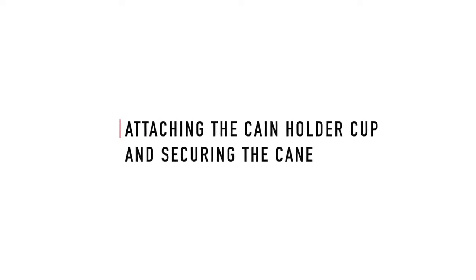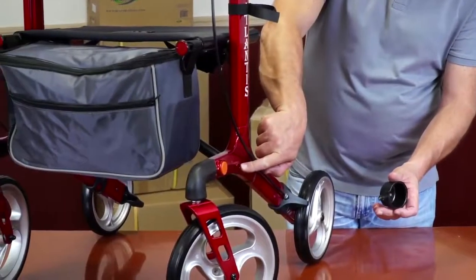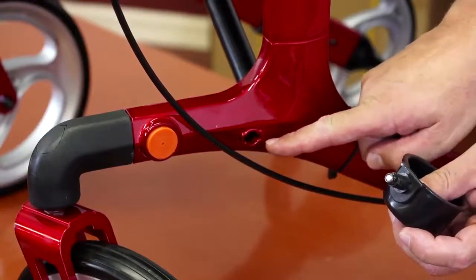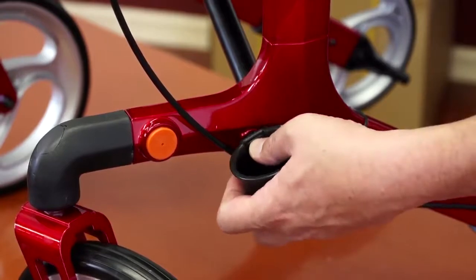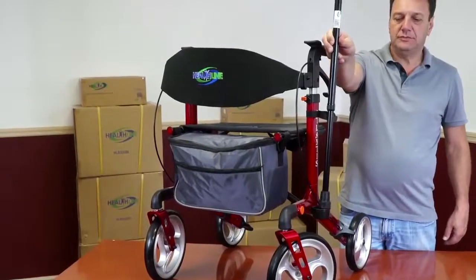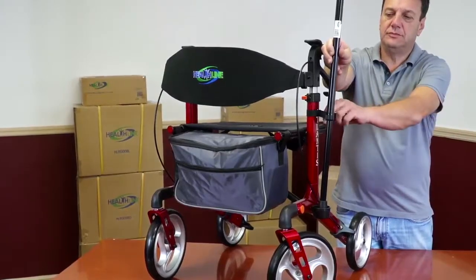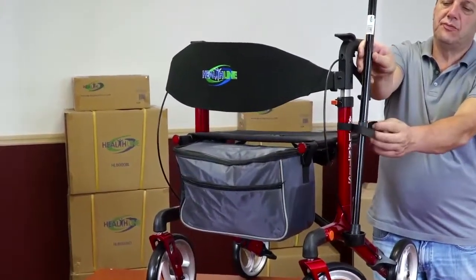Attaching the cane holder cup and securing the cane. Insert the cane holder cup into the hole on the side of the rollator. Place the tip of the cane into the cane holder cup. Secure the upper part of the cane with the Velcro strap attached to the rollator frame.